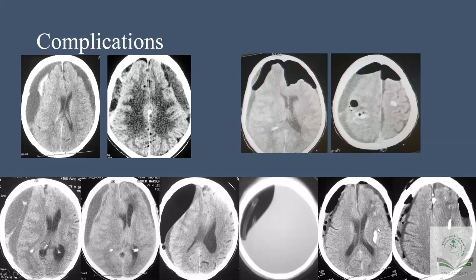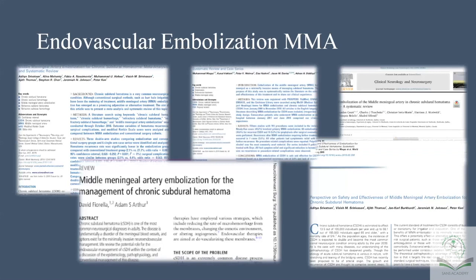This is another one. You see the drain, which was supposed to be subdural, is now in the parenchyma with a lot of air trapped in, and so on and so forth. So the message is, we have to be real careful and pay attention to the surgical steps and maneuvers that we perform. Especially neurosurgeons should have very delicate and smooth hands on wounds and brains.